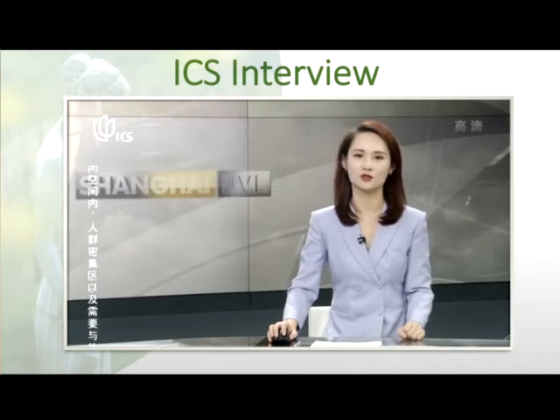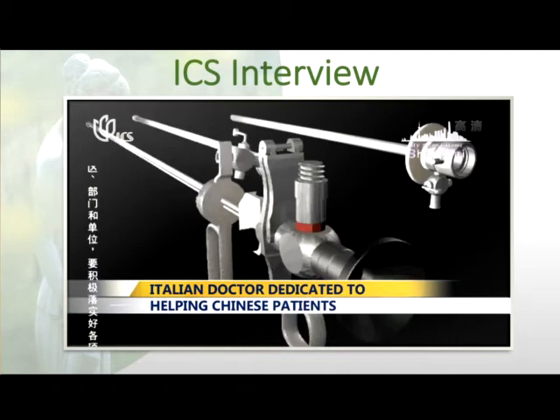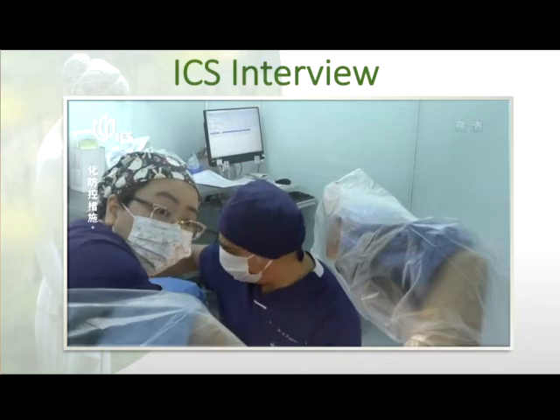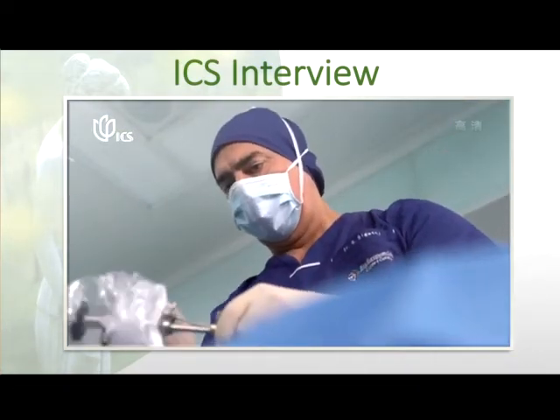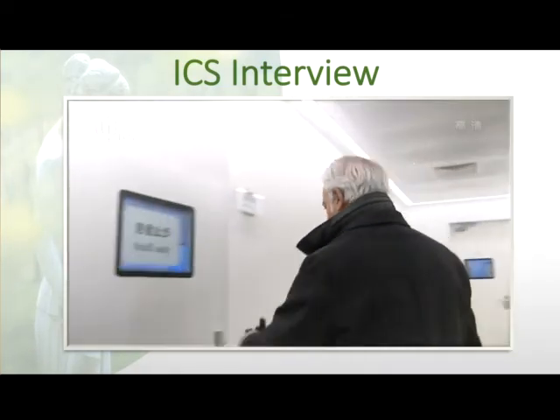He's the first foreign doctor with a full-time job at a state-owned hospital. Reporter Zhang Yue tells us more about the Italian. The Intrauterine Bigatti Shaver, or IBS, is a tool doctors use to examine and treat the inside of the uterus. It's acknowledged as the safest and most precise instrument in the field of hysteroscopy, and was invented by 58-year-old Italian doctor Giuseppe Bigatti. Bigatti works as the director of the Sino-European Life Expert Center at Renji Hospital, focusing on intrauterine diseases, which are common among women between 40 and 50 years old.